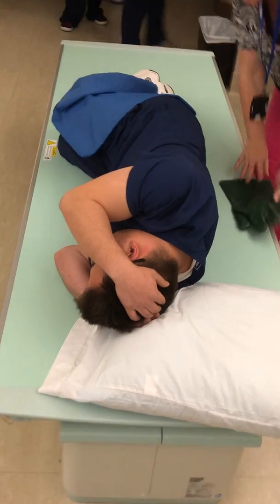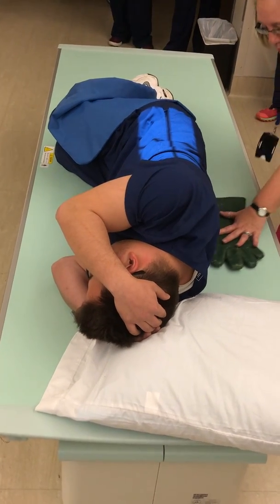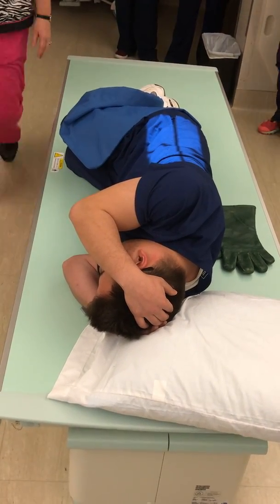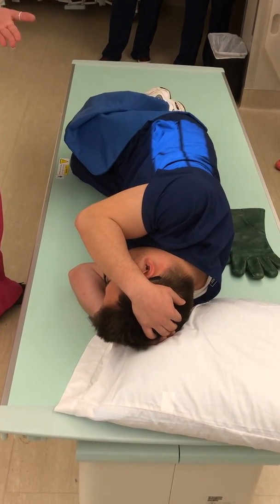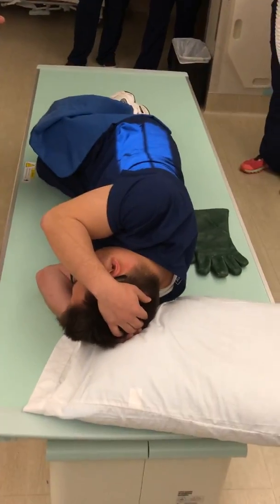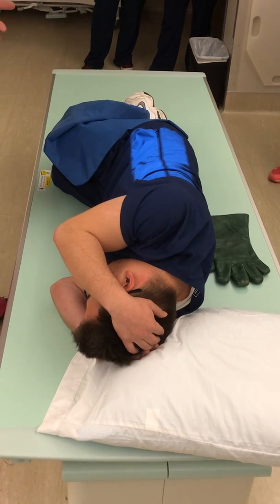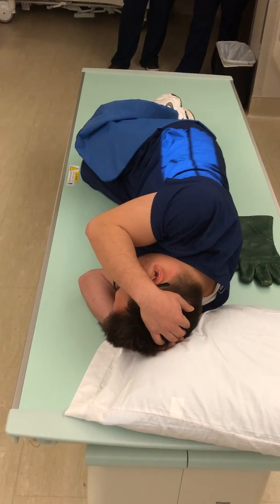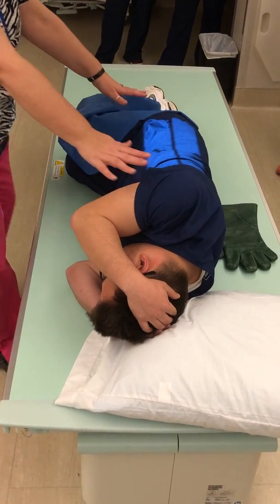With the patient on the table, you can put some lead behind the patient to absorb excess scatter, but don't put it up under or in the light field, just behind the patient to absorb scatter. Now for our technique, from whatever you start as an AP, you're going to need to increase incrementally. From AP, go up a couple of kVp steps, so probably 3 or 4 kV from AP to obliques. Keep those the same. And then up another 3 or 4 kVp from the obliques to the lateral. Okay, blow all your air out, hold it out, breathe and relax.